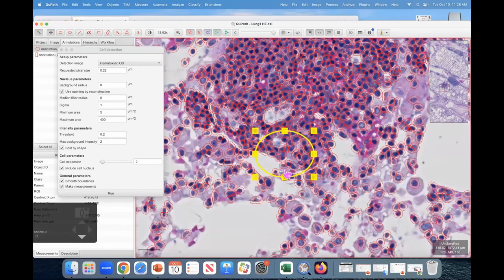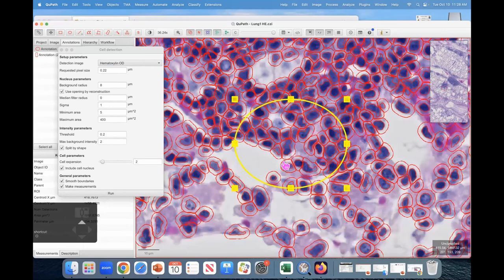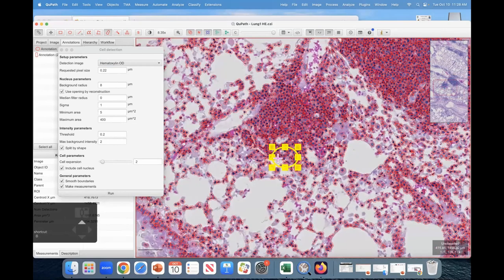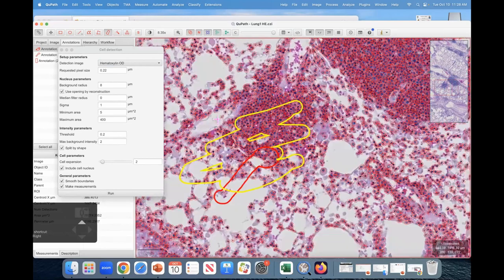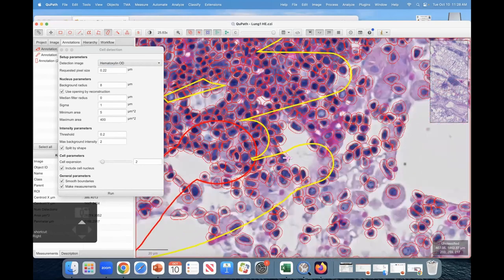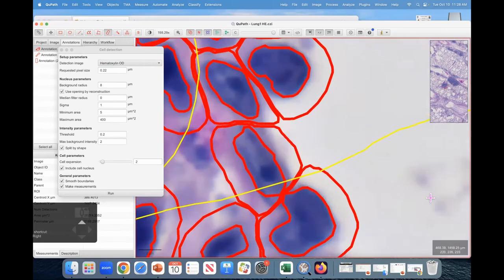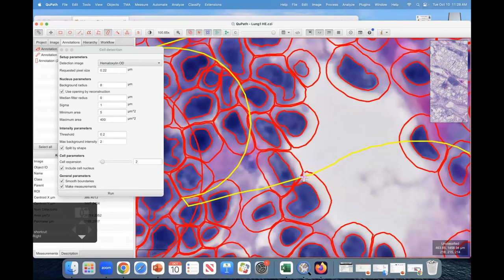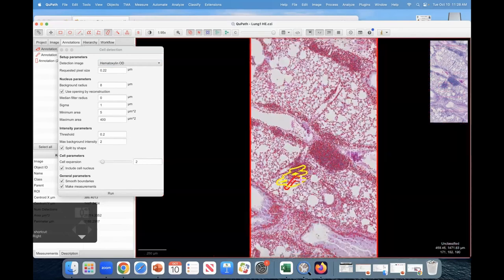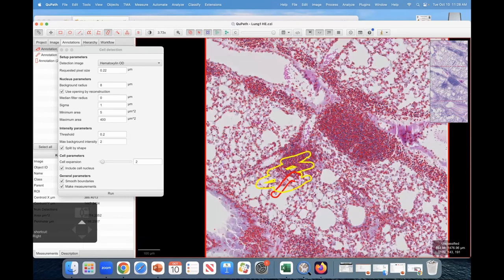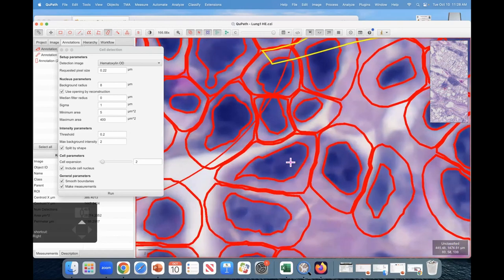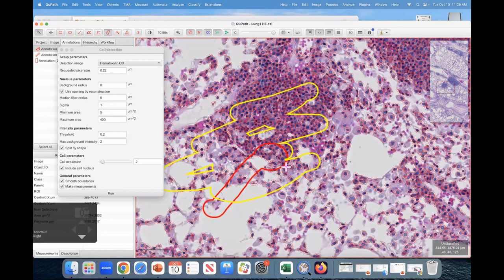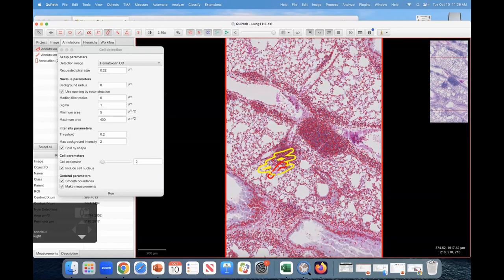As you zoom in and as you zoom out, that annotation is redrawn on screen every single time that you do anything - as you move around it has to be redrawn every single time. It might not be entirely obvious why, but the thickness of this line remains the same, and that's why we have to redraw every time. As you zoom out, you can still see it because the thickness remains the same. The other type of object you need to care about are detections, and that doesn't happen with them - you should see that as you zoom in on a detection the lines get thicker, and as you zoom out they get thinner.